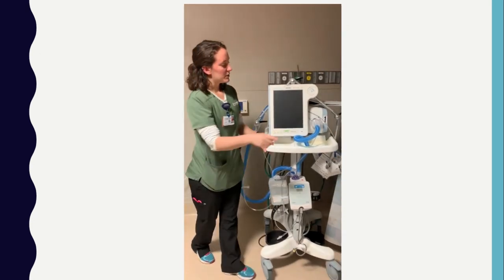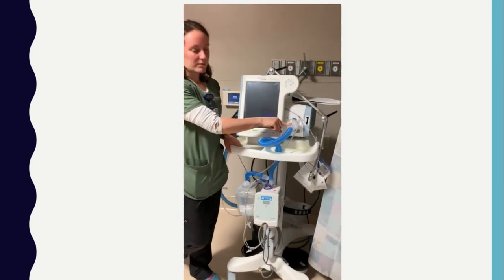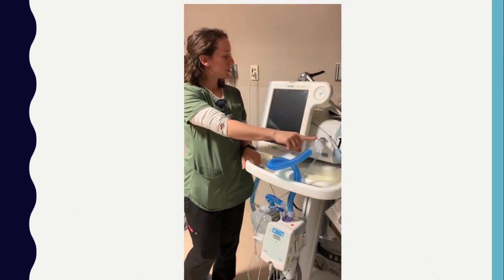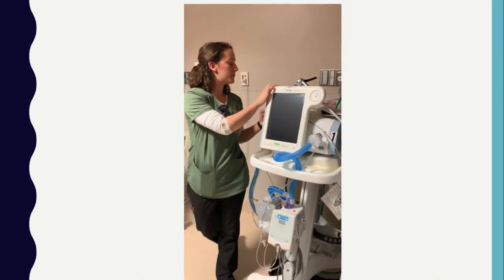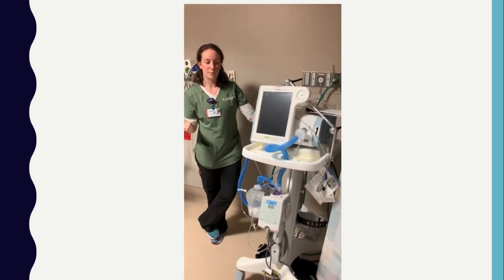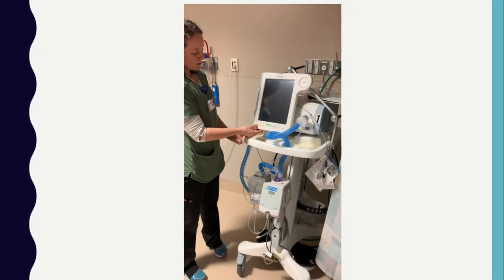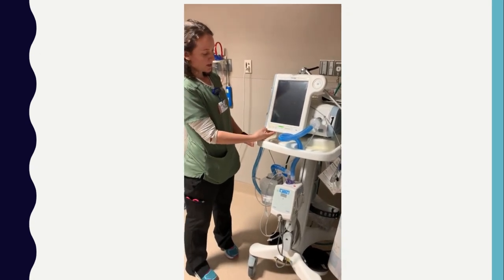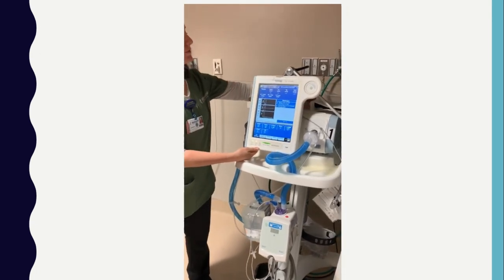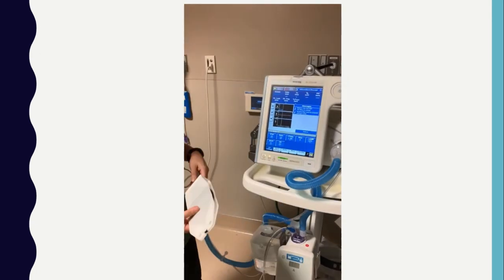We also want to check to make sure that we have a filter here. We need to have one of these on every single BiPAP that we are using. So make sure and double check that, as well as it being plugged in. The battery will last for about 6 hours, but we do want to keep it plugged in unless we're transporting the patient. For these, you're just going to press the on button right here. Everything will turn on. And I have a little test line connected for it this time.